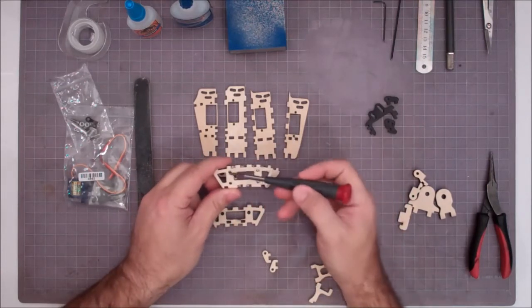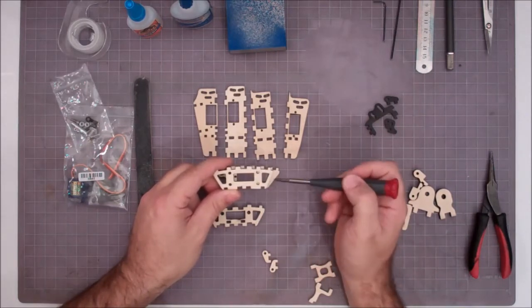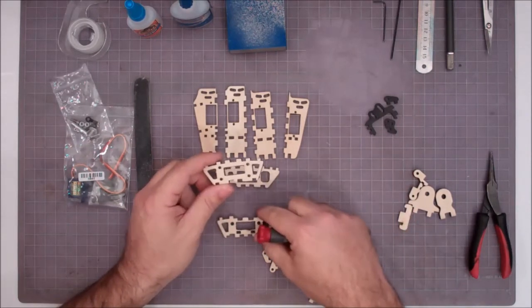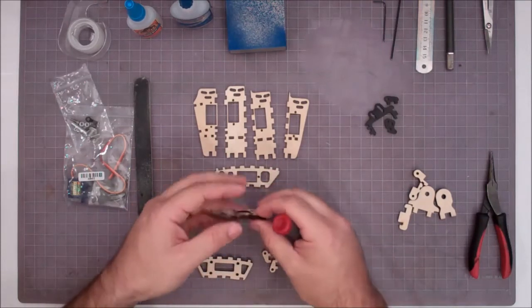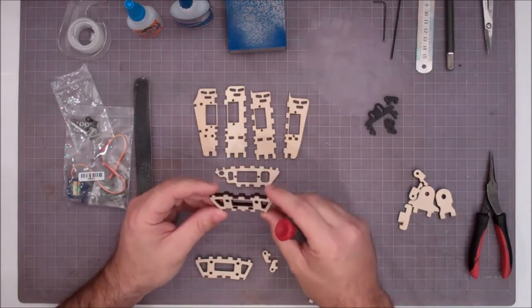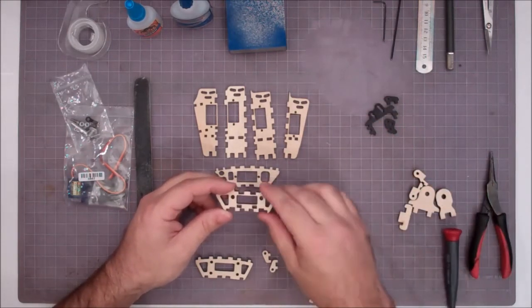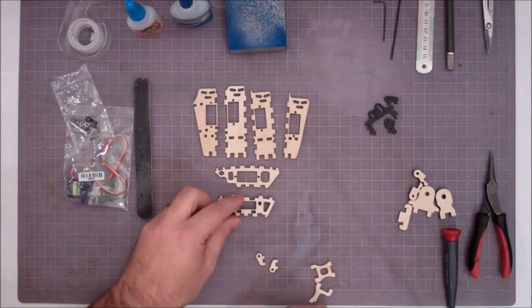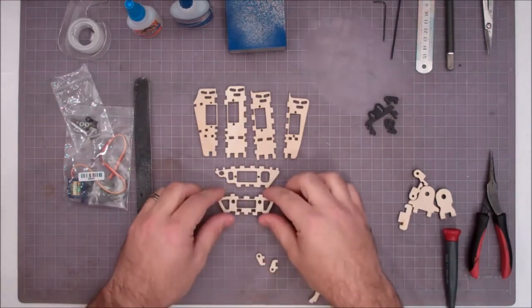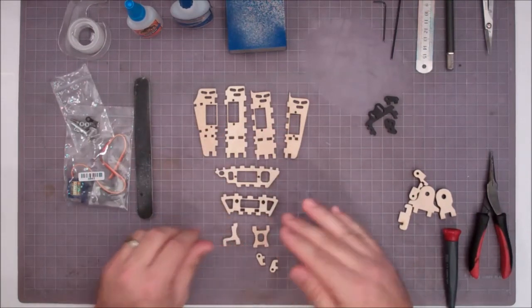So I can also tell by the fact that this triangle is a little bit bigger on the thumb side, where this triangle is a little smaller. So either way works. I'm going to go ahead and build with the plate for making the arm, because these videos continue on as we put together the arm, but your plate may look like that without the extra holes. So we're going to put that one there. And lastly are these 2 little brackets. They just go down here at the bottom. They'll get fitted in as we go.